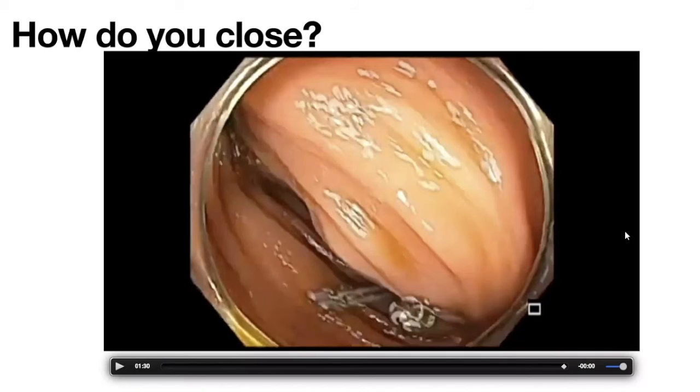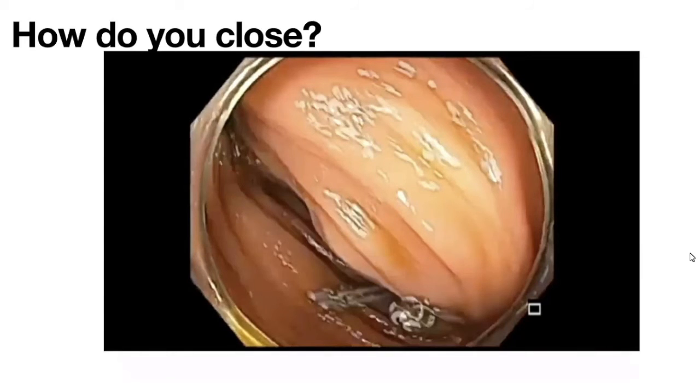Let's hear what Naria, what do you do, sir? In my practice, the same. I also use NBI observation. But I want to ask, do you use panchromoendoscopy, put the indigo carmine in from the syringe flush, or put the dye into a water pump? In the water pump. Oh, yeah. I see. In the water pump, yes.